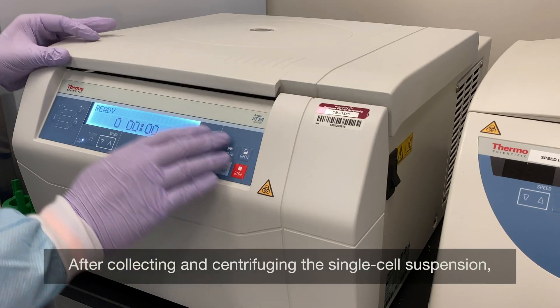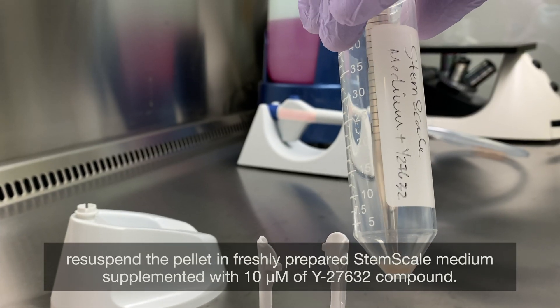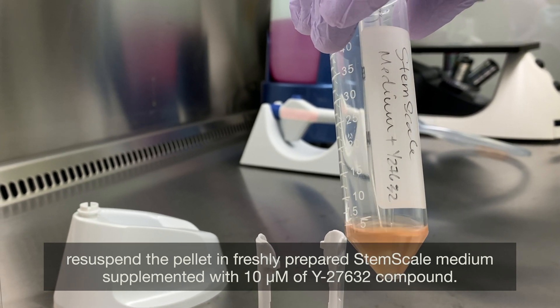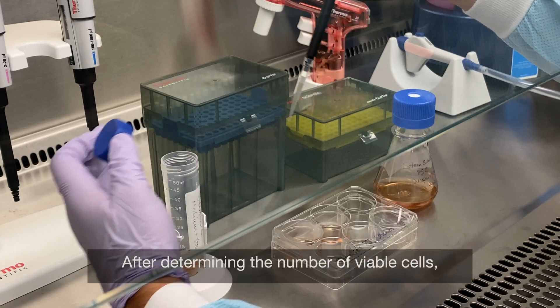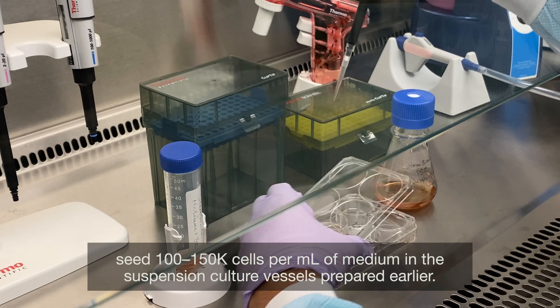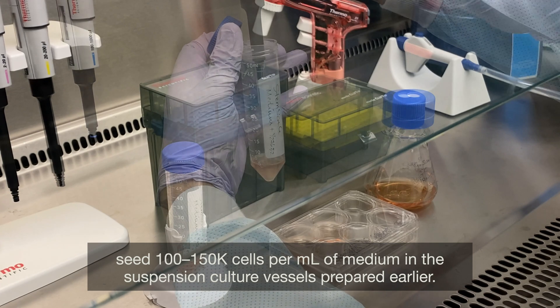After collecting and centrifuging the single cell suspension, re-suspend the pellet in freshly prepared StemScale Medium supplemented with 10 micromolar of Y27632 compound. After determining the number of viable cells, seed 100–150,000 cells per mL of medium in the suspension culture vessels prepared earlier.